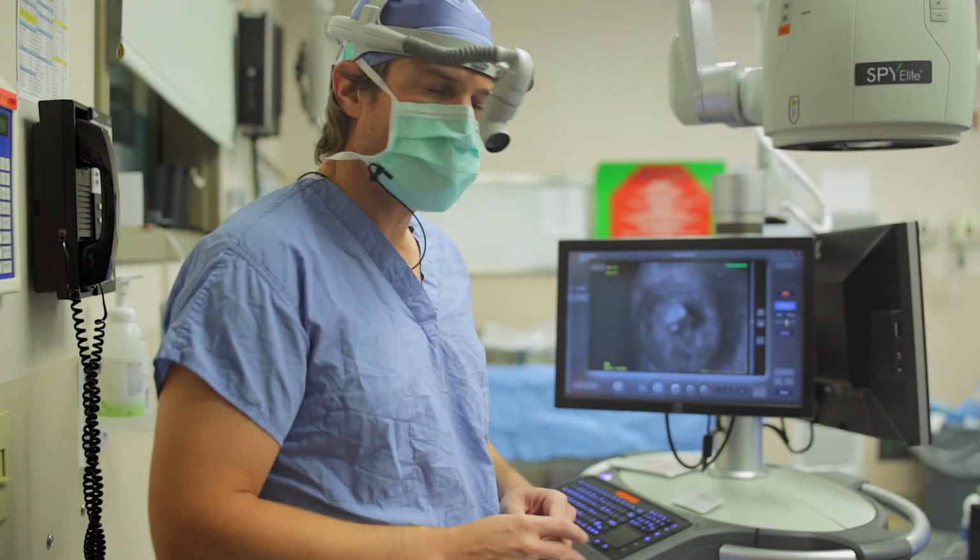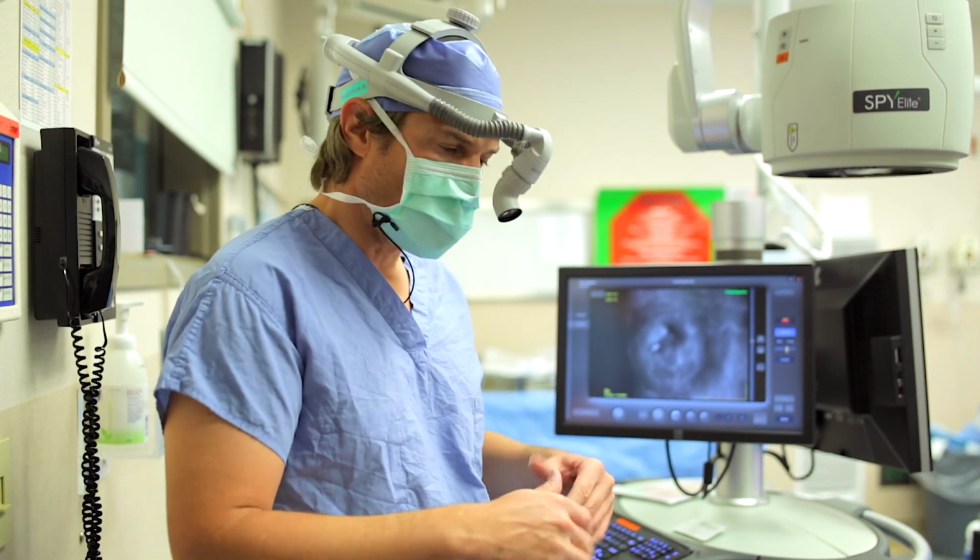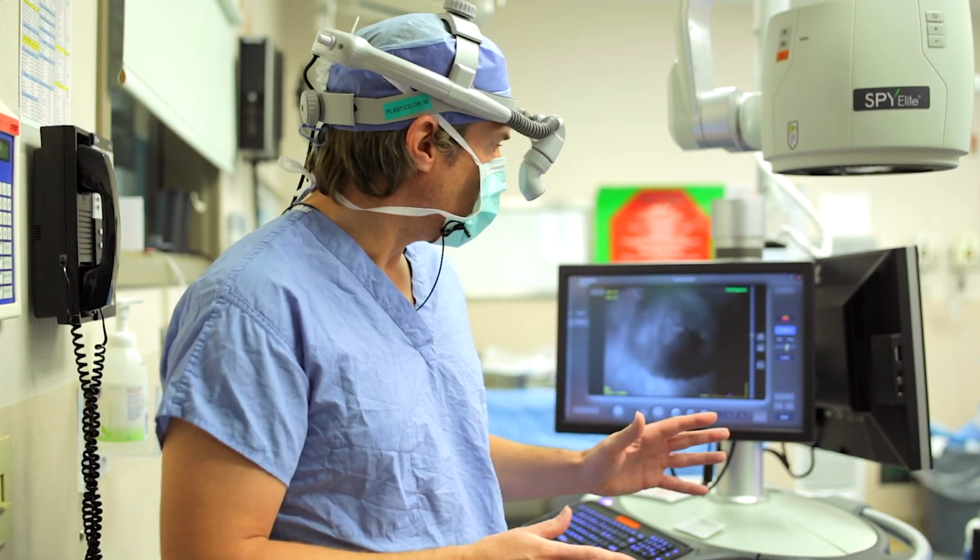And then with just a little bit of time, we're into about a minute into the study, you can see the white perfusion of the nipple. So I know with great confidence, we're not even going to have a scab at the tip of the nipple post-operatively. She's going to do very, very well.